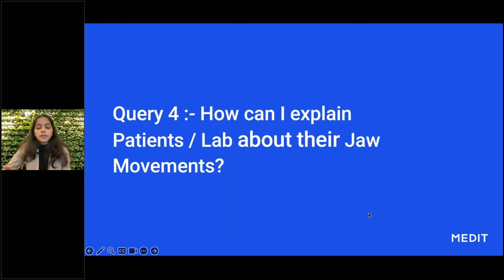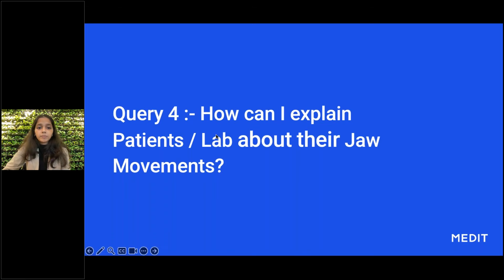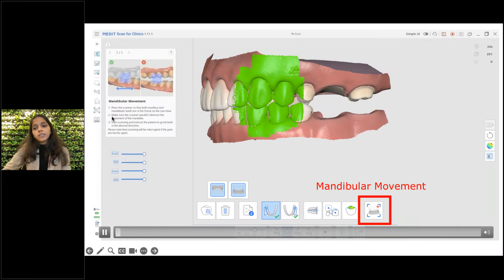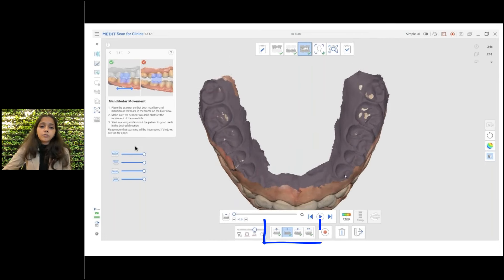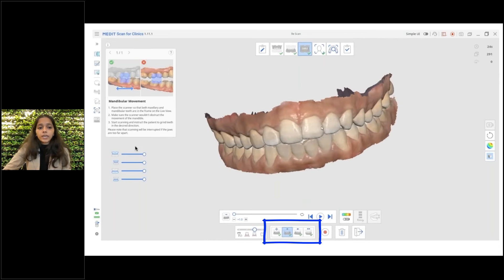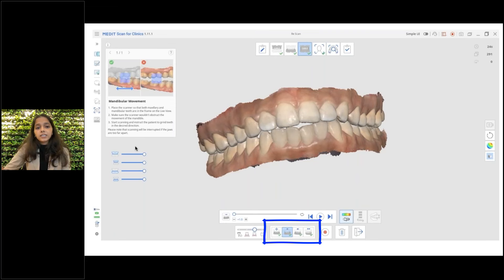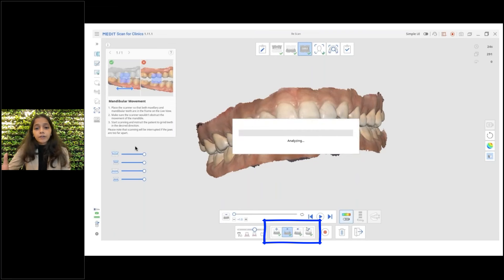This is another feature — how we can use mandibular movements in our regular day-to-day practice. In mandibular movement recording, you can record four bites: the habitual bite, the left and right lateral movements, and the protrusive bite as well.